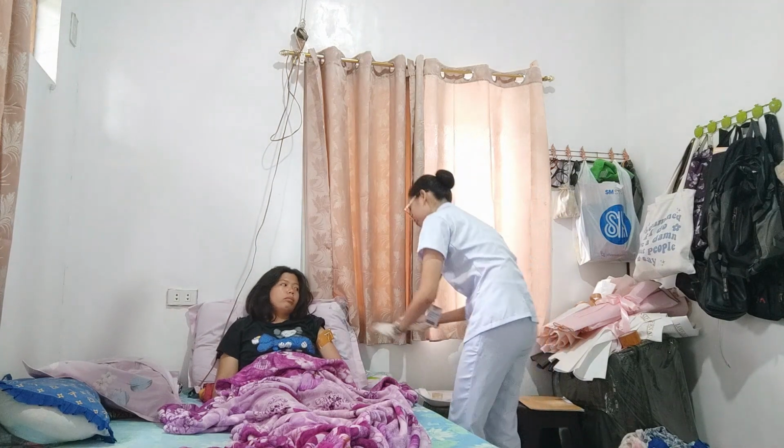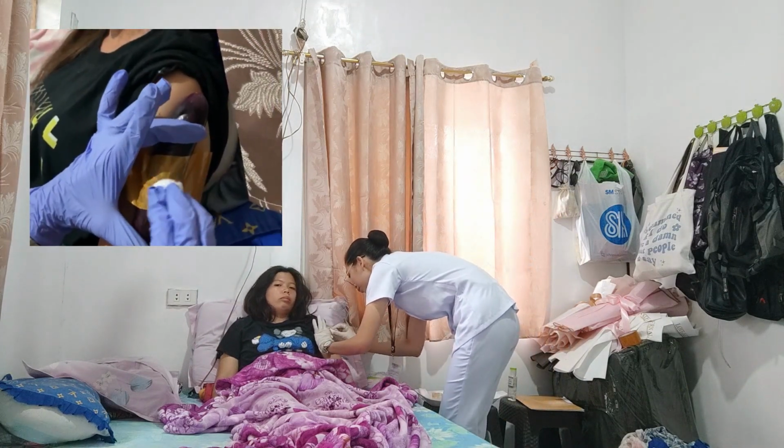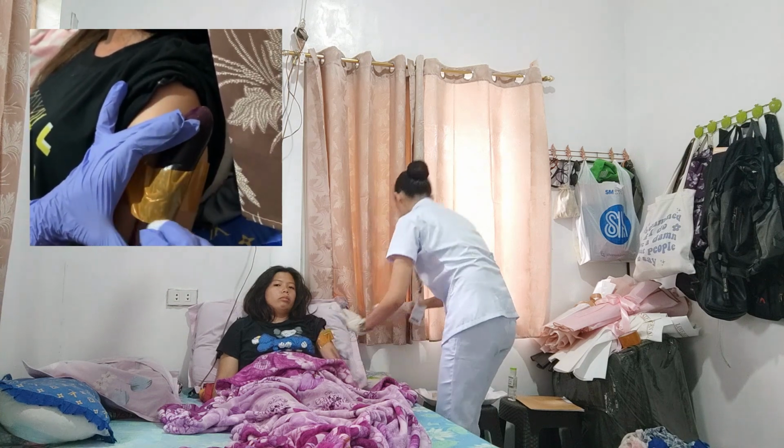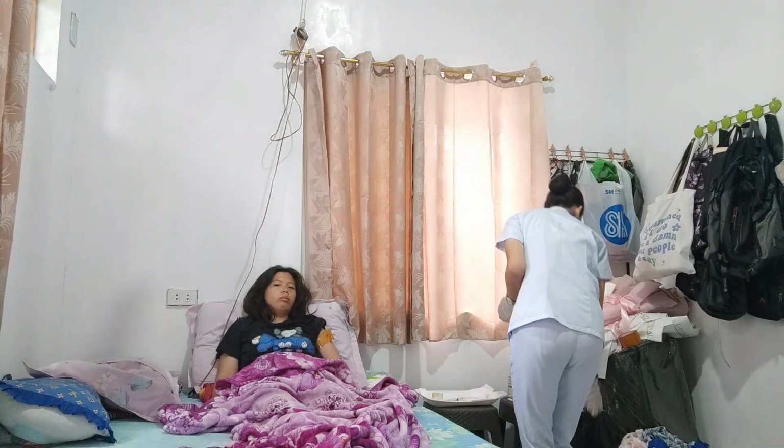Now, we are going to use an antiseptic swab or a cotton ball soaked in alcohol to clean the site, starting at the center, circling outwards. Then dispose the used cotton ball. After that, we're going to get our syringe with the medication, remove the cap, and hold it between the thumb and index finger of our dominant hand as if we are holding a dart.